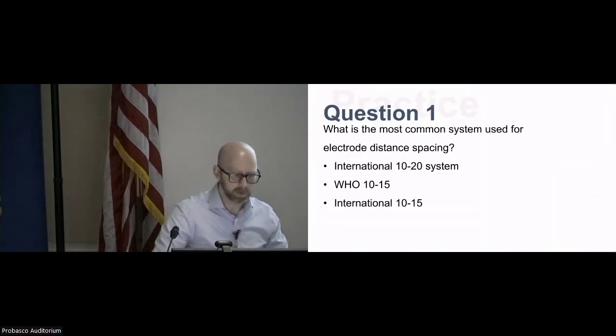And so, a quick quiz. That's just the basics. We'll get more fun stuff now. What's the most common system used for electrode distance spacing? Is it the International 10-20 system, the WHO 10-15, or the International 10-15 system?